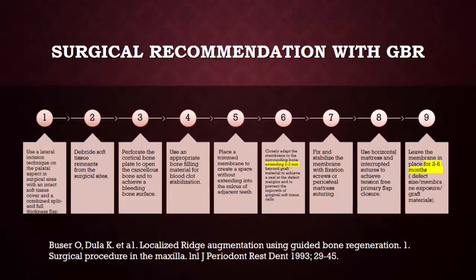So let's talk now about the surgical recommendations within the GBR. What is the main protocol that we need to follow in order to get a good result? So according to the Buser study, which is a very well-known study, here they describe a specific protocol for the ridge augmentation or the GBR.